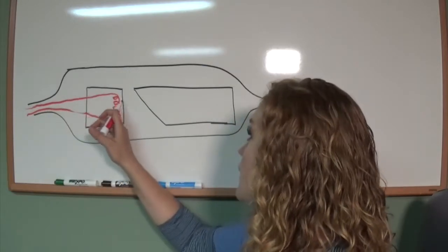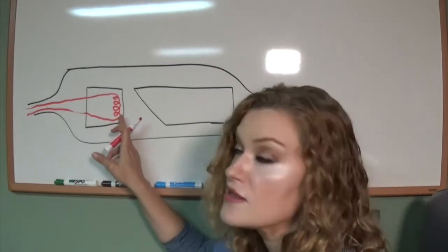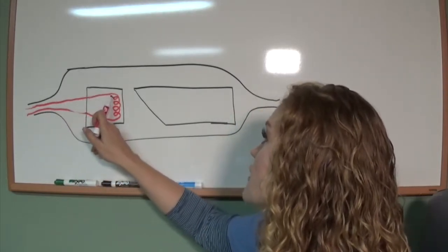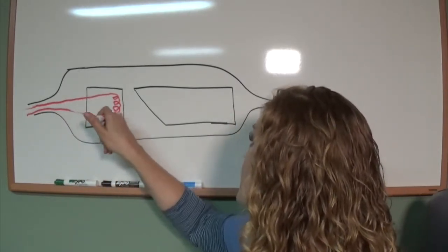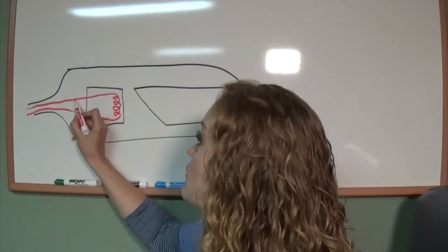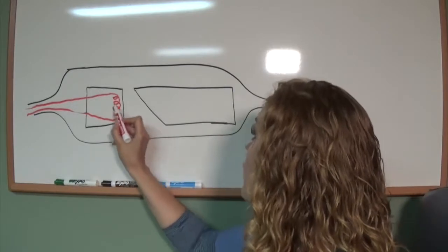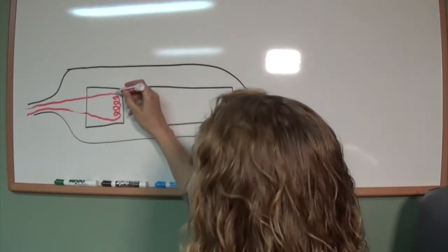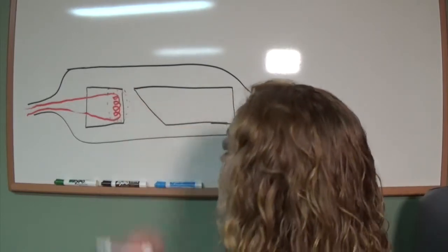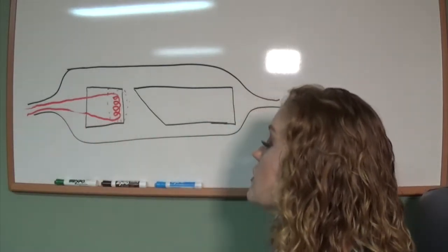One of the parts that we just made here is called the tungsten filament. And this is the most important part of X-ray production, this tungsten filament. Because what ends up happening is you have a whole bunch of electrons coming down this wire. And the fun thing about electrons, when we just simply have a wire, they don't stay in the wire themselves. They actually float around the wire. And then once you start doing this spinny thing on the wire, they end up making what's called an electron cloud. And they end up spinning around the wire itself. And then some of the electrons will go ahead and escape out.